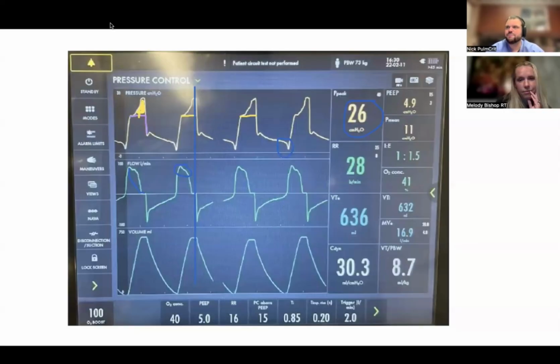They can't seem to grasp that pressure support is a fine mode to be on as long as the patient's spontaneously breathing and you're not going to provide some medication to prevent them from breathing. So if you took the patient off propofol or Dex to do the trial, and they get a little rowdy and you think they need sedation back on, then that's one situation where you might want to go back to a controlled mode to be a bit safer. But otherwise, I like to leave patients on pressure support.